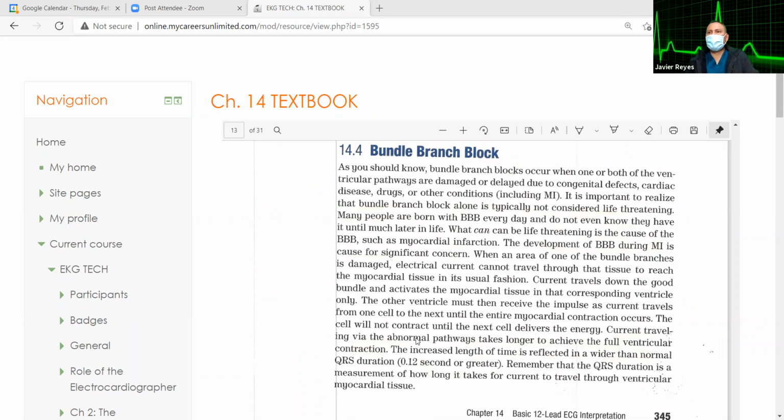So this is an additional part of the name. You might have an arrhythmia with an underlying rhythm, and then you might also be able to detect deviation. Again, this would have to be on a diseased heart, somebody that's had a condition like emphysema, had a heart attack in the past, and so on.